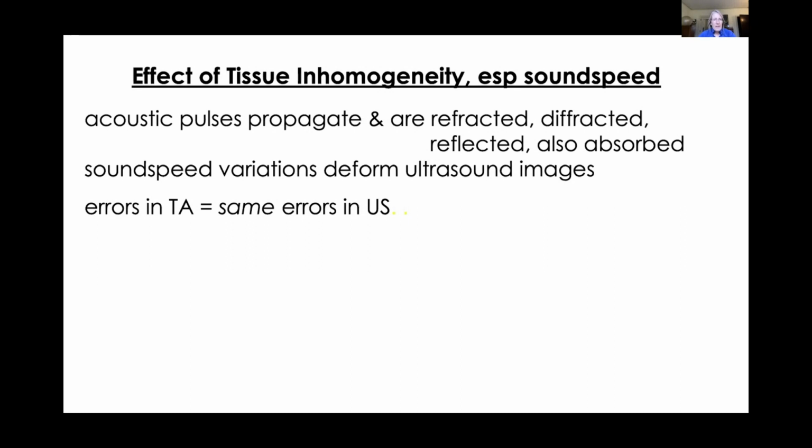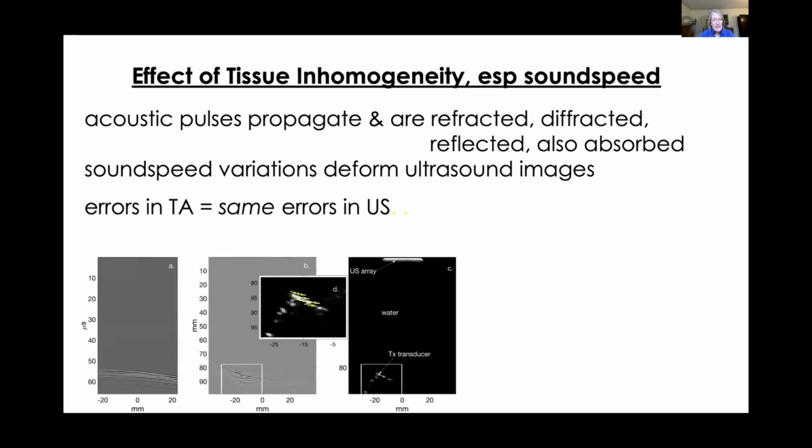But the errors in my thermoacoustic range estimates will be comparable. And so we'll have very good co-registration to the ultrasound image that we've collected. So here's an experiment that I did in my lab that was then corroborated during the argon experiment. If I use a single element transducer with a metal housing to transmit a signal to an ultrasound array above, I measure a waveform that arrives after about 55, 60 microseconds. And if I back project these time series, I get this image here. If I overlay it onto the ultrasound image that's created of that empty water field, I see my transmitting transducer, and the overlay in these two boxes is really very good.